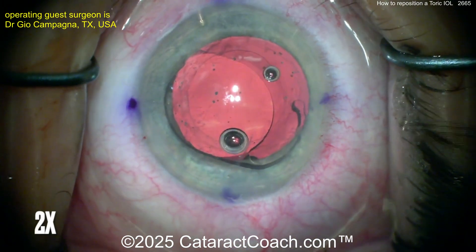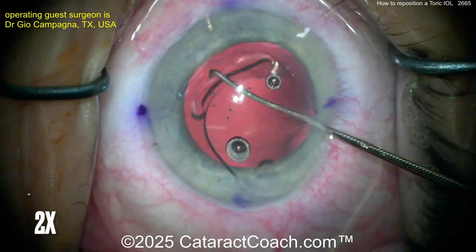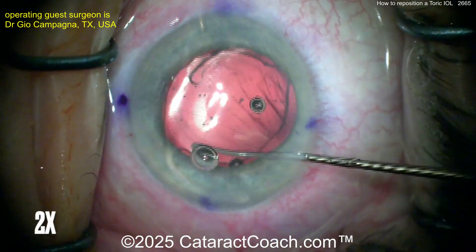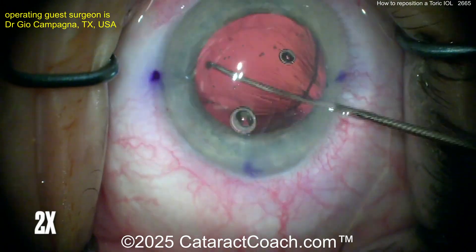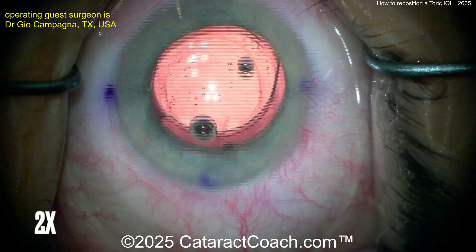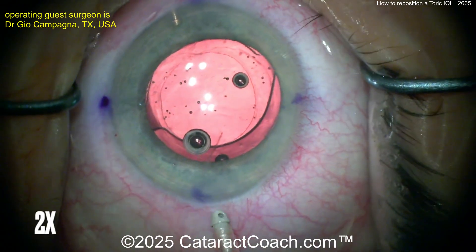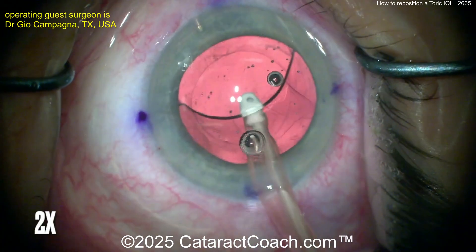Now it's totally freed up. Get it in the right position and get those haptics where you want them. The surgeon puts it back in the bag and rotates the lens to good position. Sometimes it's also helpful to put a capsule tension ring in the bag — that can give the bag a little more stability for holding the toric lens in position. Let's get that thing rotated where you want it.